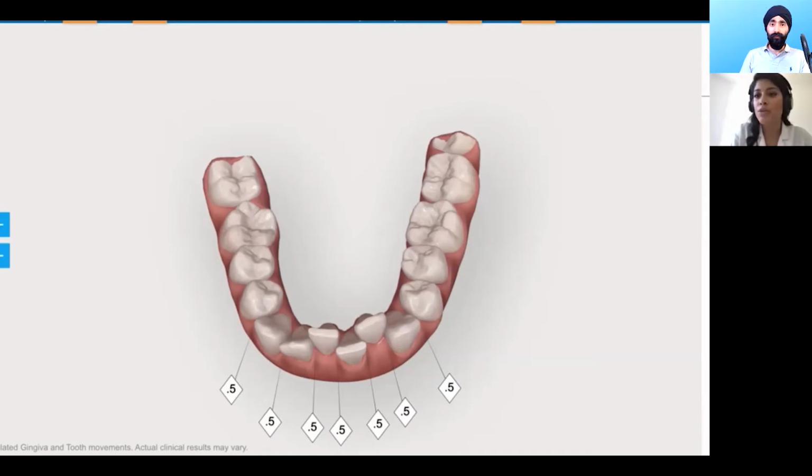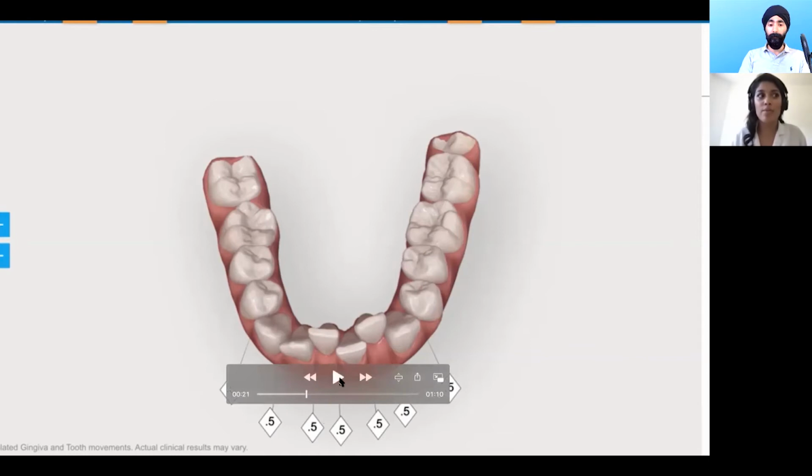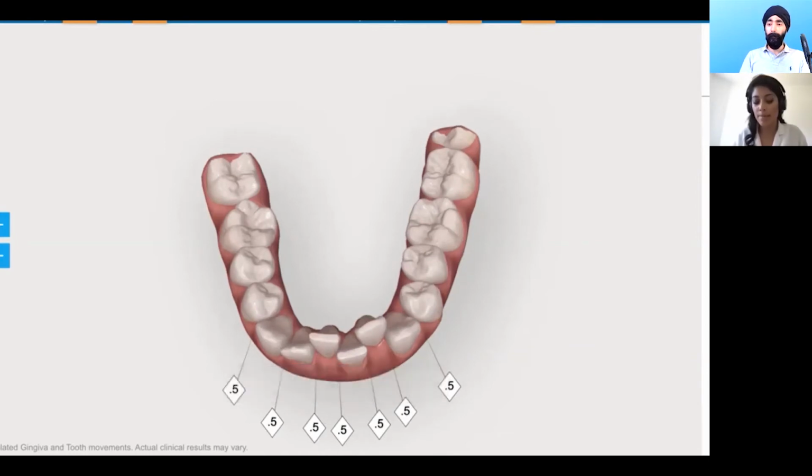I could liken it to how floss feels when you're taking it through a contact point. It just needs a little bit of a nudge, but not to the point where you're ramming it down. Then you haven't done enough. So normally I spread out my IPR. I do about 0.2, for example, at a time.